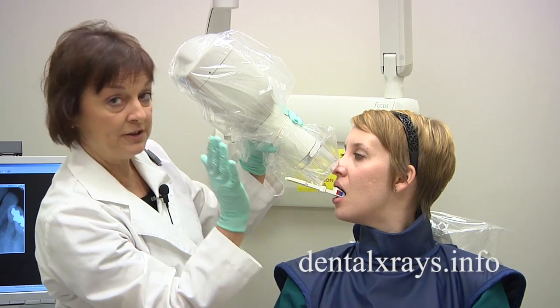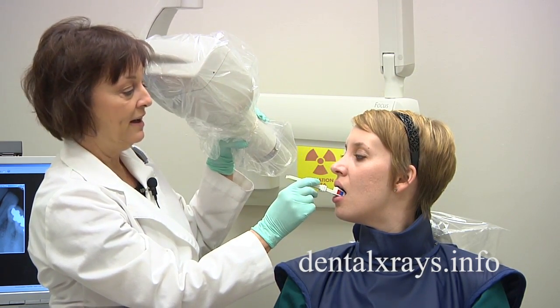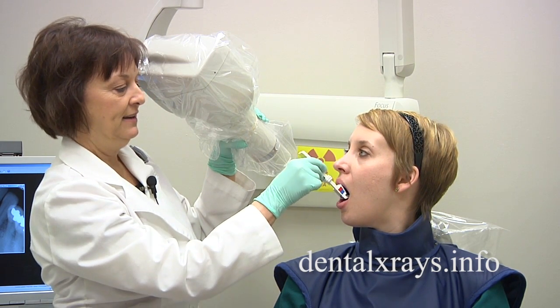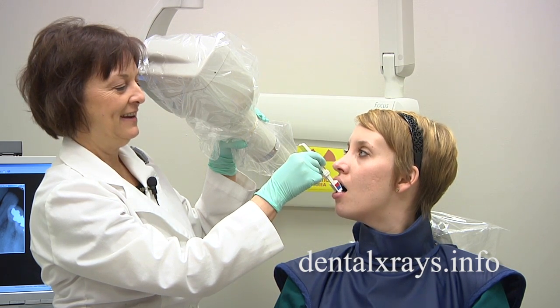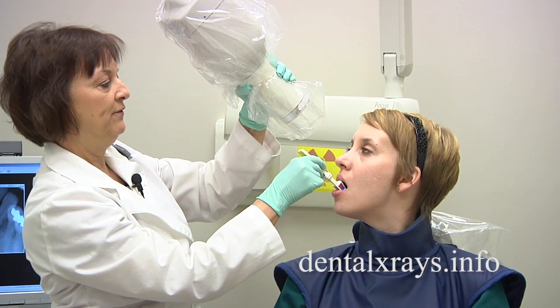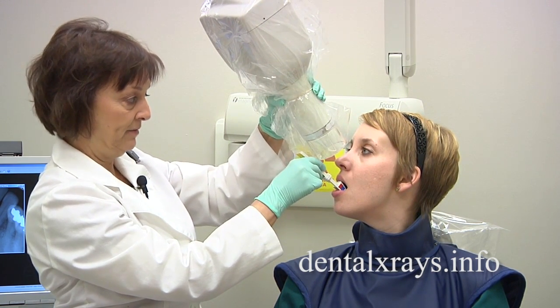Some people have a shallow arch on top, so the film itself may be sitting at a different angle. If it were to be like this, the vertical tube angle has to be increased even more to accommodate this type of mouth. If you have any other questions, please visit us at dentalxrays.info and click on Ask the Experts.